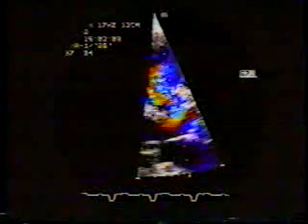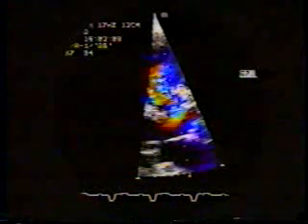In color flow mode, bidirectional shunting across the VSD can be visualized. The timing can be best appreciated in color M mode. Here is a freeze frame recording at faster speed for better delineation of shunt dynamics.